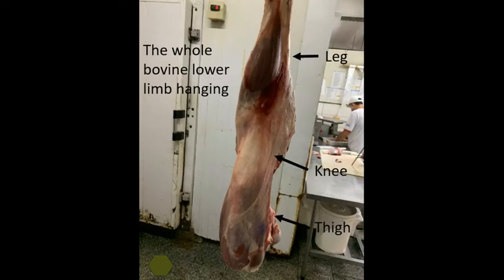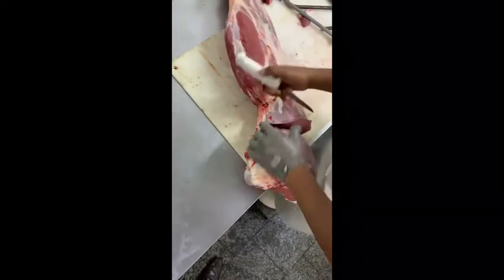In order to set up an arthroscopy lab that is easily reproducible in any region of the world, we chose to use the bovine knee. We obtain such anatomical pieces from conventional commercial establishments selling animal meat, like slaughterhouses and butcher shops.